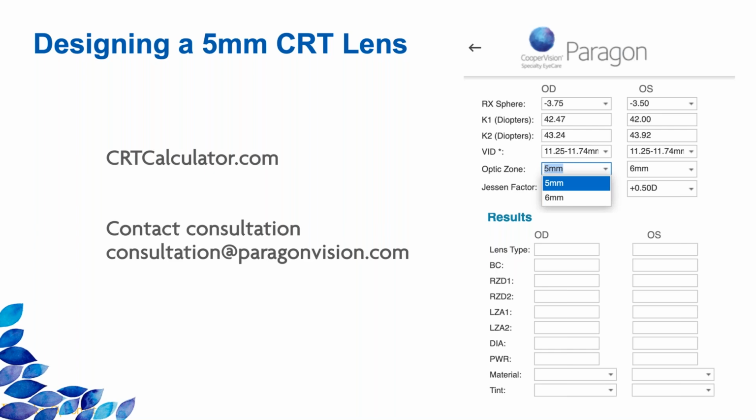If you are interested in designing a 5mm optic zone diameter lens, you can visit crtcalculator.com, and you'll see the calculator on the right-hand side of your screen right now. These are the same entry parameters if you're used to our prior calculator: the RX sphere, the K values, the VID, and then the optic zone will automatically be set to 6mm, but if you use the drop down, you can change it to 5.